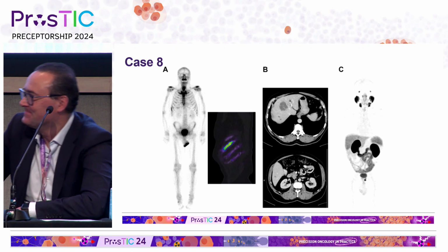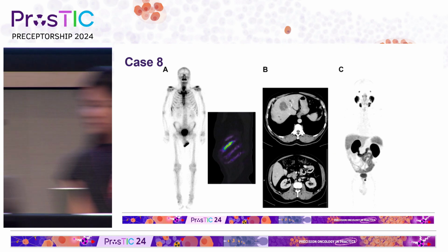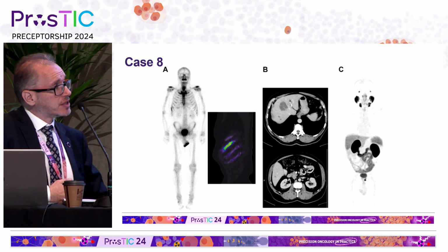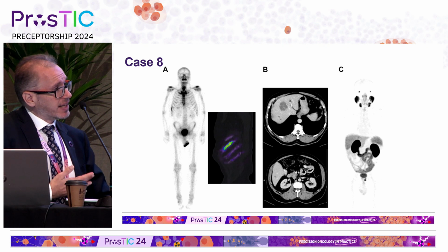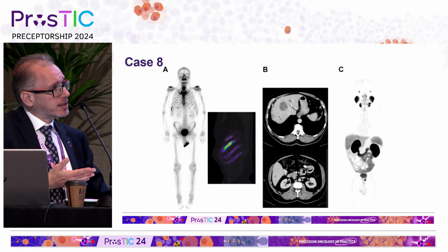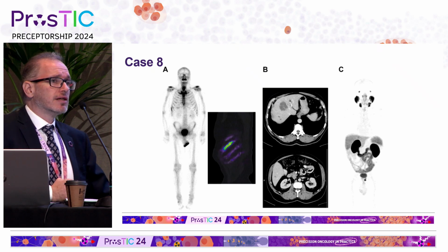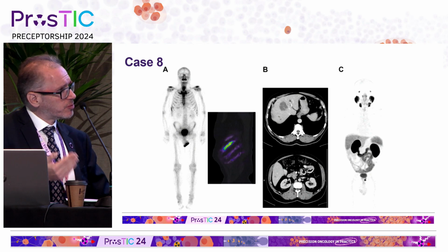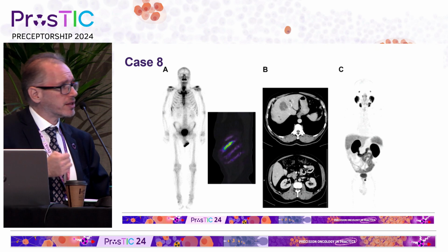So even you can get disparity between the primary and the metastasis. Good. Yeah, and one of the things we see in the therapy study is a lot of patients with FDG positive, PSMA negative lesions, around 20% of patients in that advanced prostate cancer population. When we did the therapy study, I think we thought that was due to multiple lines of therapy, development of resistance, PSMA negative clones, tumor heterogeneity.